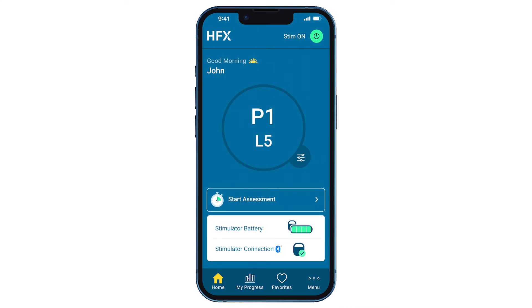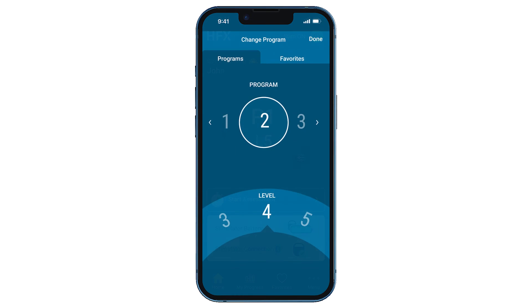First, open your Nevro HFX app and tap the Change Program icon. At the top of your screen, you'll see your current program setting.